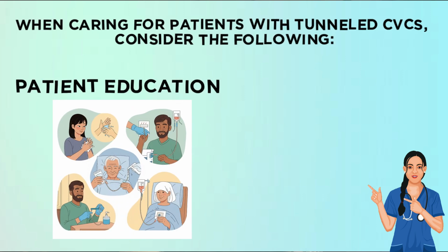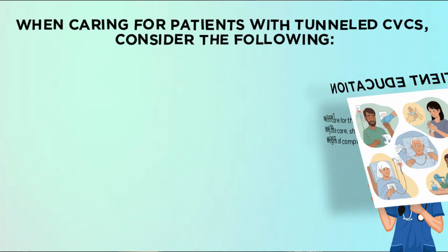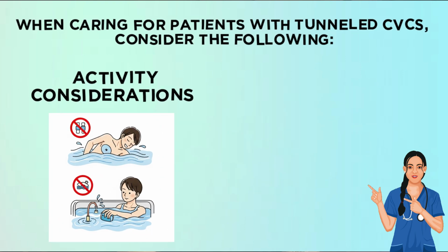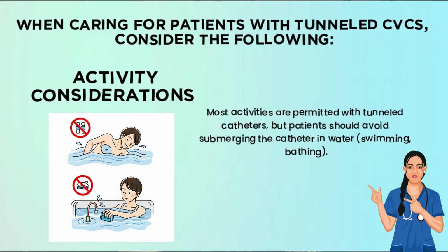Patient education: teach patients how to care for their catheter at home, including site care. Activity considerations: most activities are permitted with tunneled catheters, but patients should avoid submerging the catheter in water, swimming, and bathing.